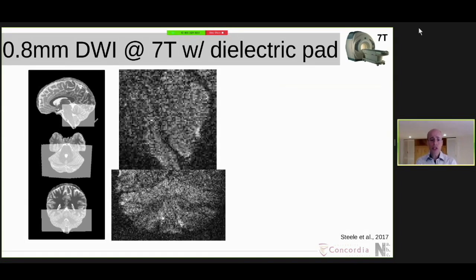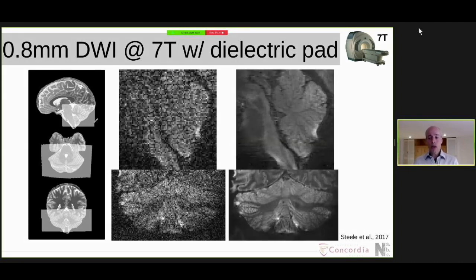So when we acquired our initial images, which is what you see here, this is one diffusion-weighted direction, one sagittal slice on top, slice on the bottom. They didn't look amazing. You can obviously tell some structure out of it, but there's a lot of noise in there. But thankfully, in 2015, 2016, there started to be a number of individuals working on denoising algorithms for diffusion data, and that's now common and standard in all of the big packages. So MRTrix has a pretty good one, as does Pierre Coupe's group, who also has a very nice one.